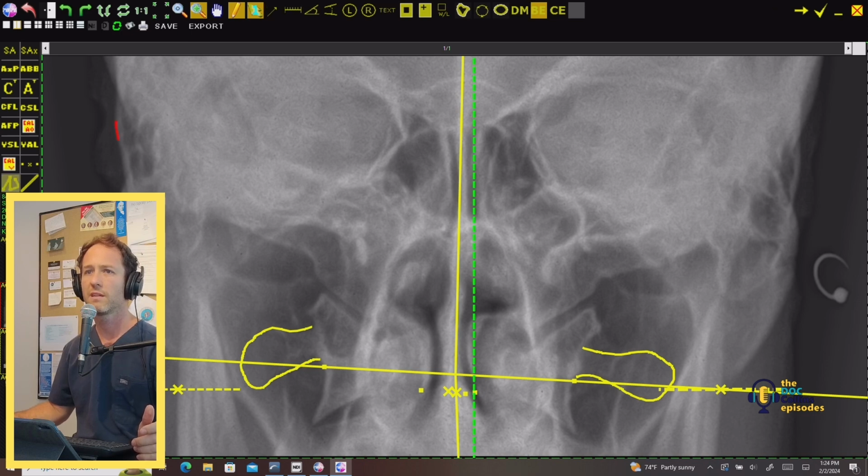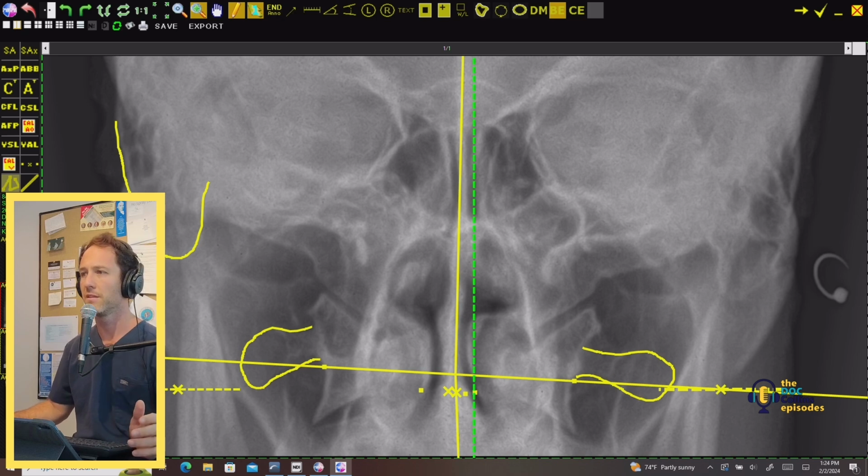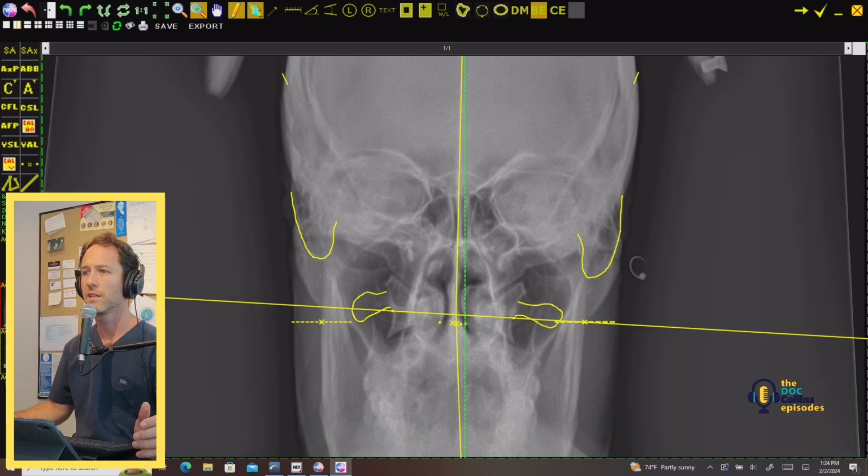How do I set you up on that headpiece? What kind of angle? When I have my films up on the screen, I have a monitor in each room, so I get to look at this. Part of the angle is looking at these mastoids in real time to get a sense of the type of angle I need on the headpiece to stabilize them.